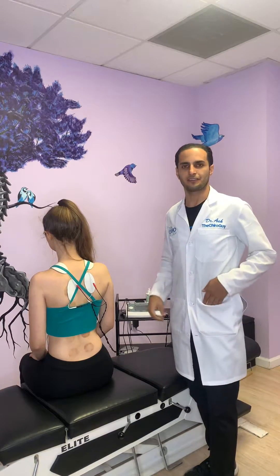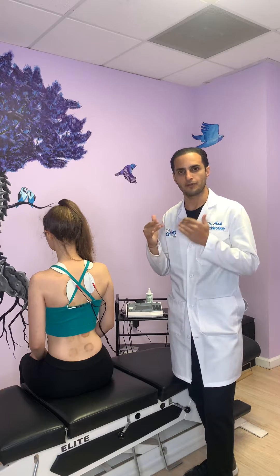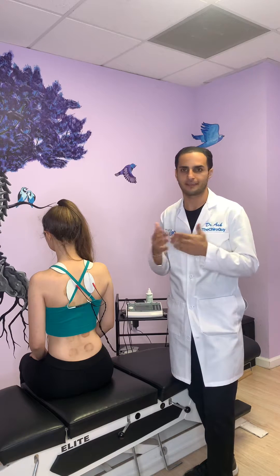Hey everyone, it's Dr. Ash, The Chiro Guy. I'm here to explain what muscle stimulation is. Electric muscle stim, or e-stim, or EMS — it has a lot of names, I know.